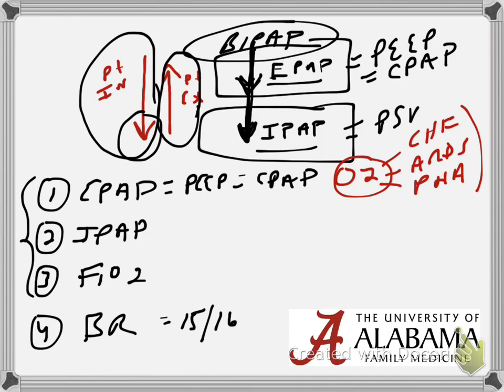If you have a patient who has fluid in the lungs, it's the EPAP that actually pushes that junk out of the alveoli, in the exact same way PEEP does in your ARDS patient who's on mechanical ventilation. If you have a patient on mechanical ventilation with ARDS, what do you do? You want higher PEEPs because it actually pushes that fluid out of there. In the exact same way, if a patient has an oxygenation problem, it's all about the EPAP.